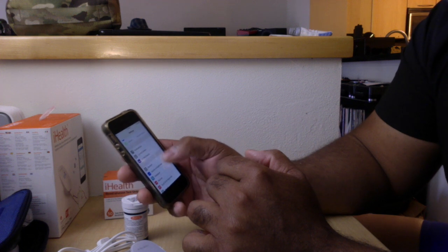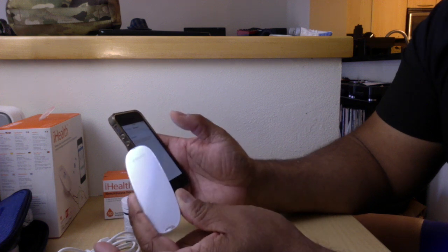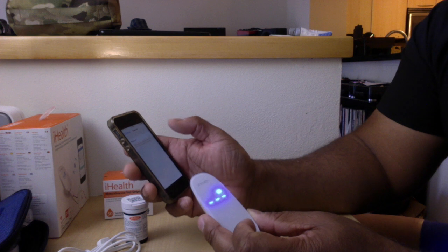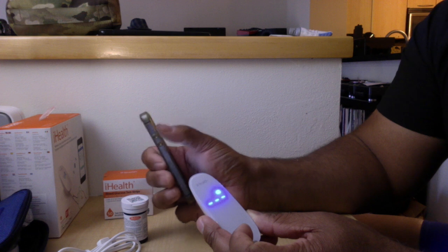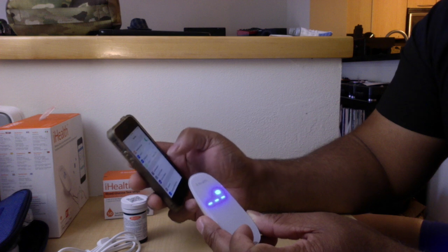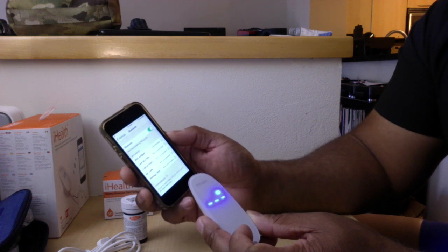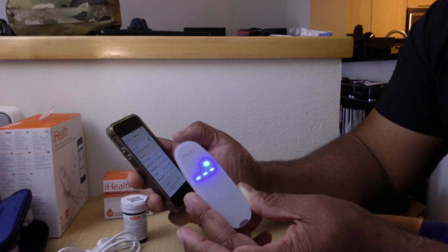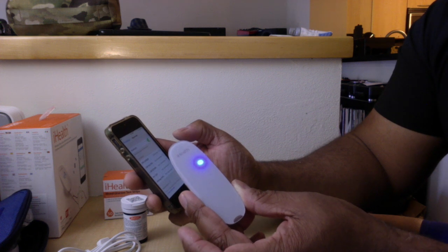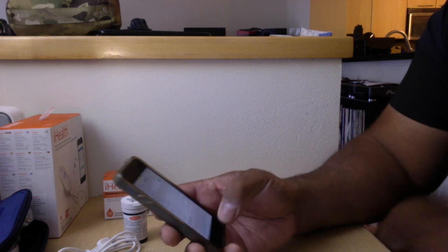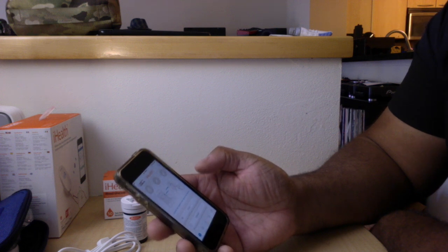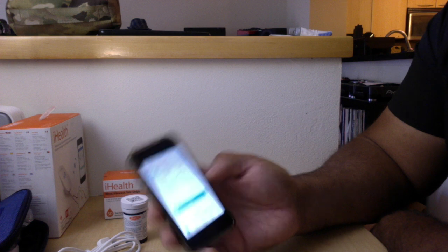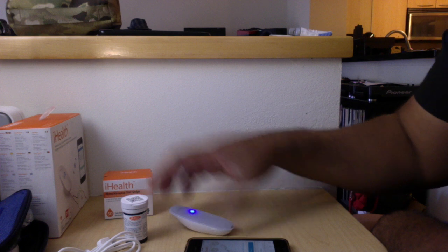The other thing it will do is ask you to connect the device to your phone, which is pretty basic. Go into Bluetooth settings here and you'll just basically push the side button. This will turn on and you'll see it pop up in your Bluetooth devices, and then it will connect. Then you can go ahead and go back into your app here and the app will connect. It'll do that and then it'll be ready to scan for your blood sugar.